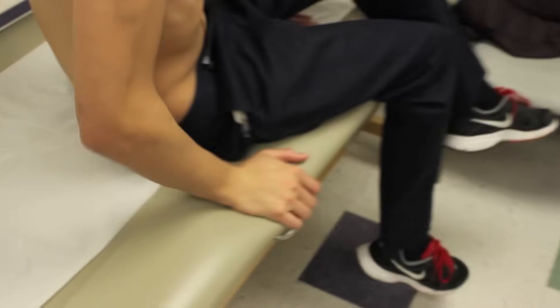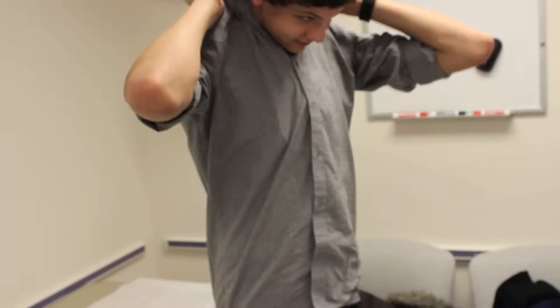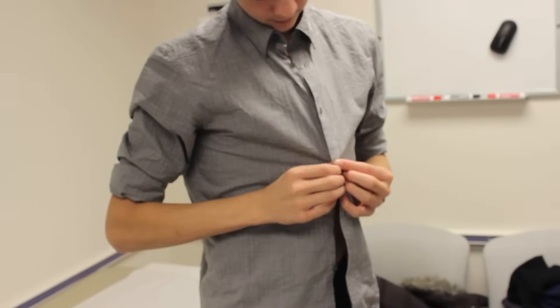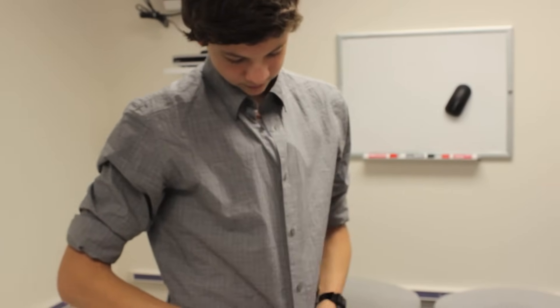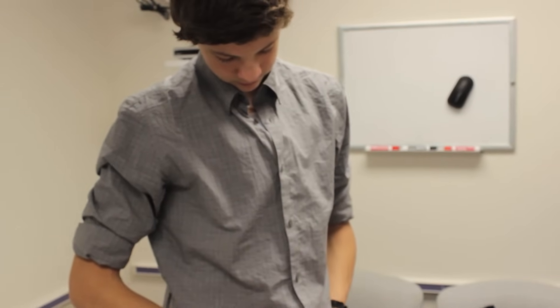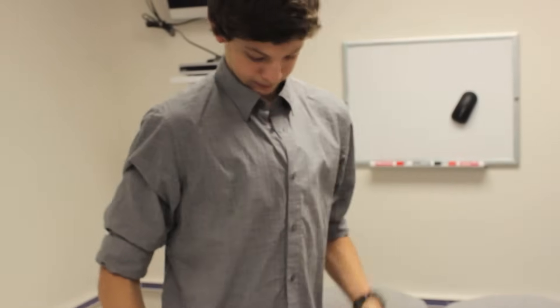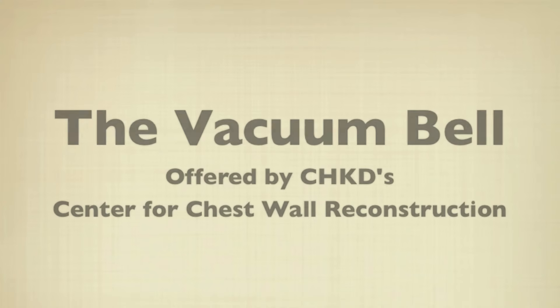Once you get your shirt on, we would ask the patient to wear the vacuum bell for approximately two hours twice a day. You can sit down and do some homework, watch a movie, read a book. Mom says play games — no.